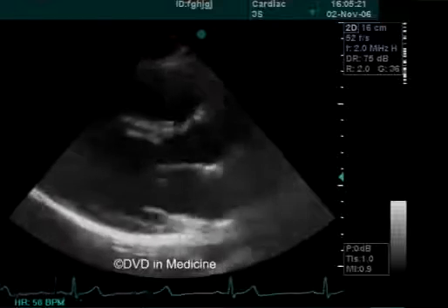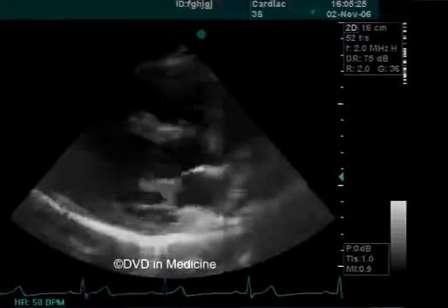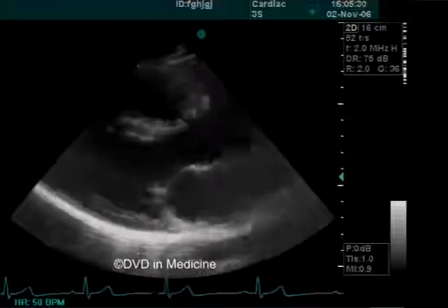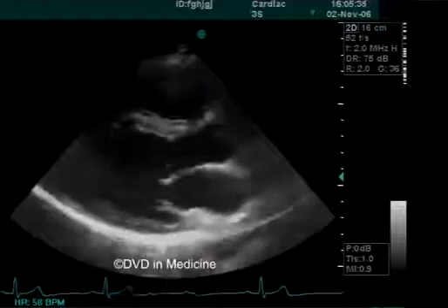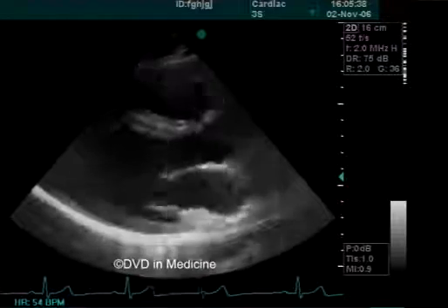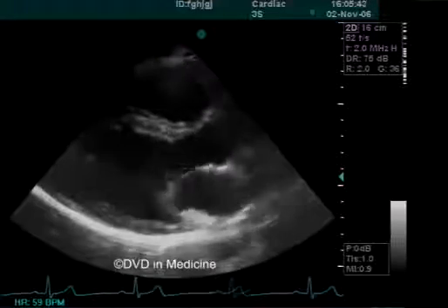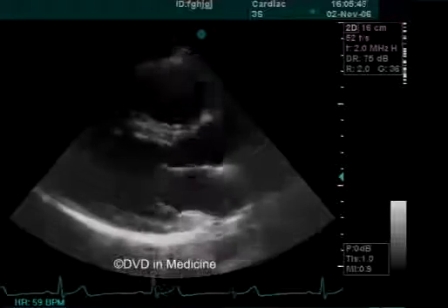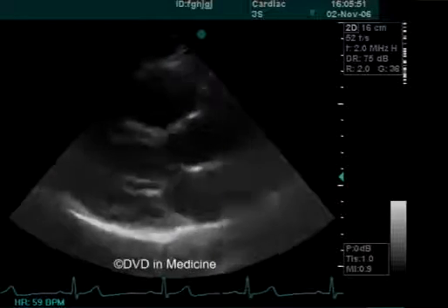8. To diagnose structural changes and dysfunctions of the mitral valve and its supporting structures, cords, papillary muscles. 9. To diagnose coronary sinus dilation. This can be evidence of persistent left superior vena cava. 10. To assess the left atrium and to diagnose masses inside it, thrombus, myxoma, membrane. 11. To perform quantitative Doppler echocardiography of mitral or aortic insufficiency.